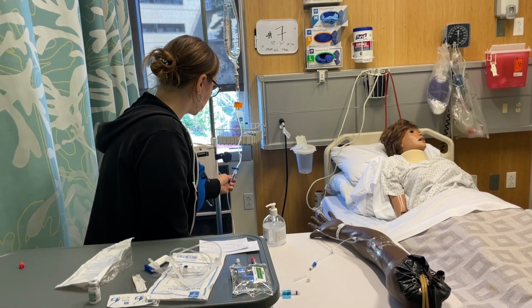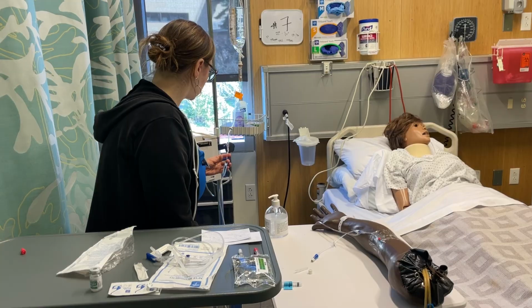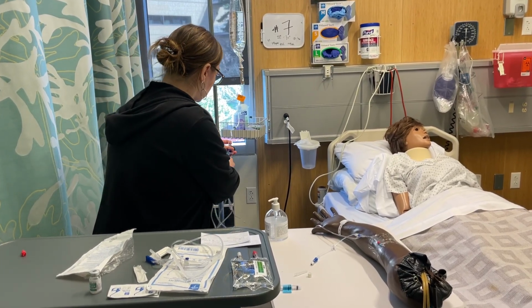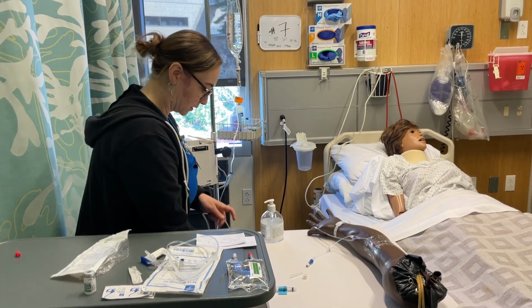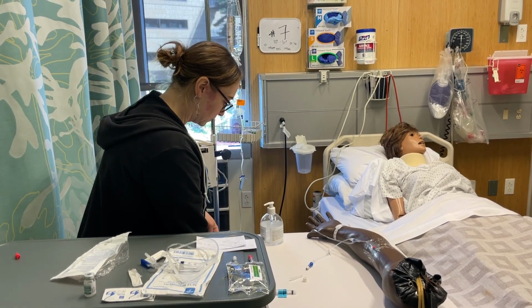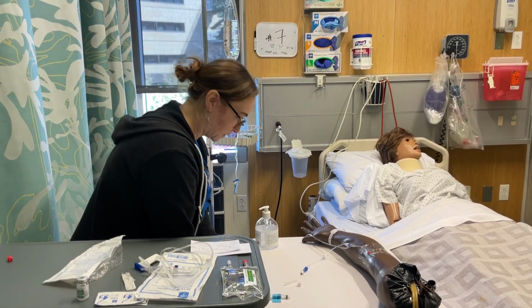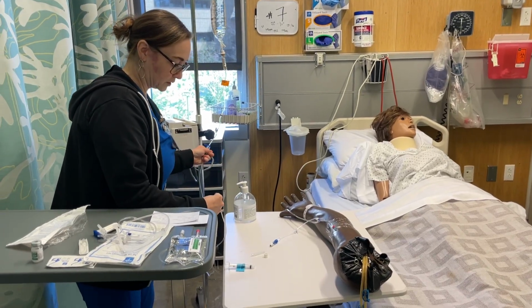Okay, it's slowly going through. Okay, here we go. There we go. Now it's coming out. Okay, so we'll lock that.